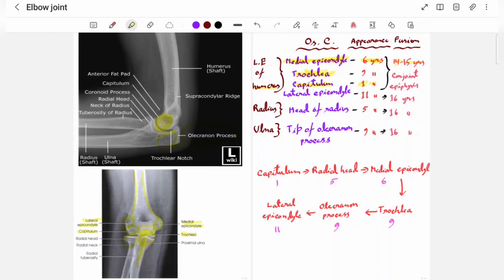Let's see when each structure appears and fuses. The medial epicondyle appears at six years of age, trochlea appears at nine years of age, and capitulum appears at one year of age. These three are fused together at 14 to 15 years of age, forming what is called the conjoint epiphysis. At 16 years of age, this conjoint epiphysis fuses with the lower end of the humerus. The lateral epicondyle appears at 11 years of age and fusion occurs at 16 years of age.